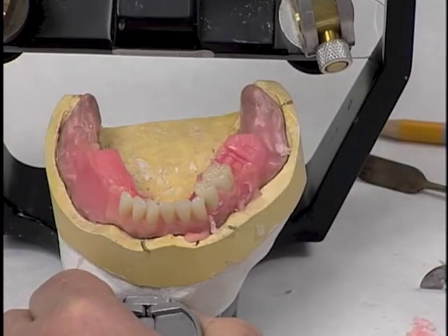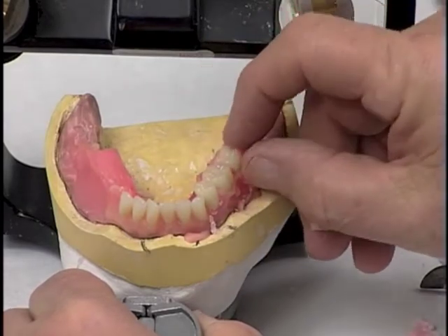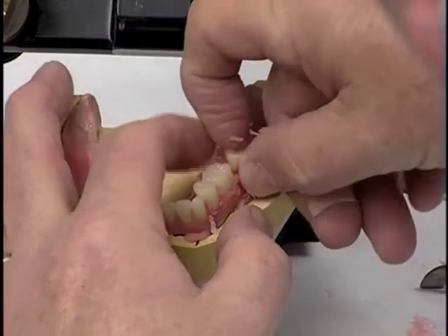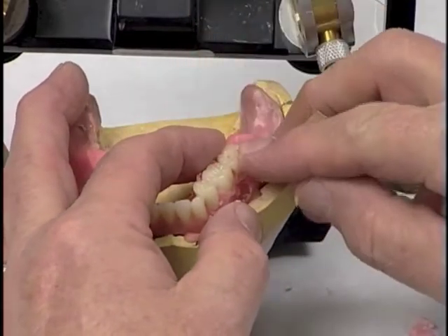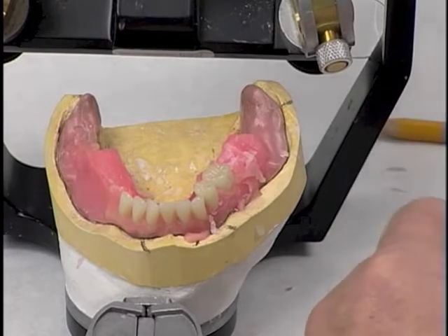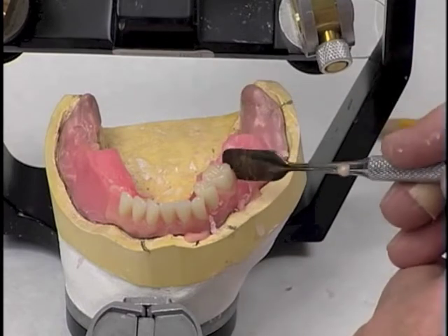Once we have the wax pulled, again, place the tooth. I haven't pulled the wax quite deep enough, and that's why I'm having problems arranging that tooth. So we'll pull it a little more out here on the buccal.